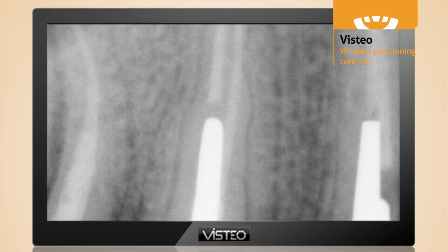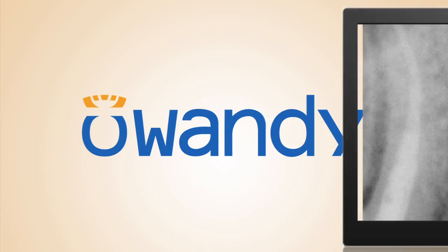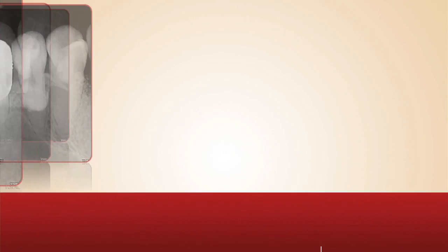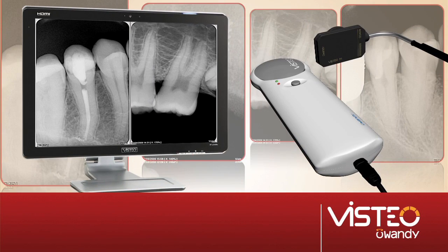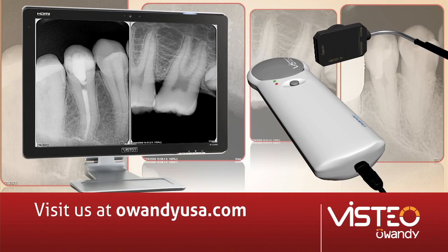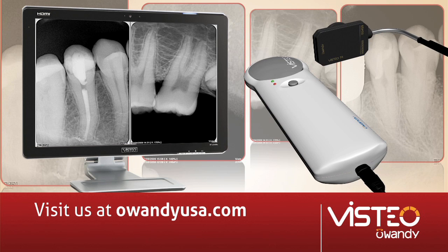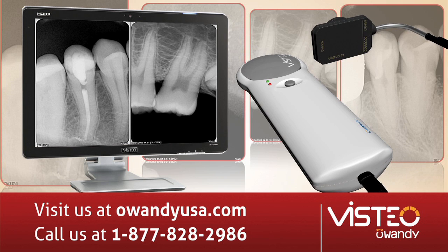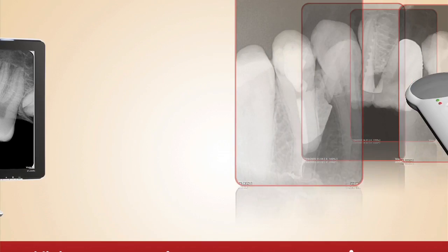Diagnose with the state of the art in image quality. Awandi products integrate with all major practice management software available. For more information on Vistio sensors, please visit us on the web at awandiusa.com or call us at 1-877-828-2986.